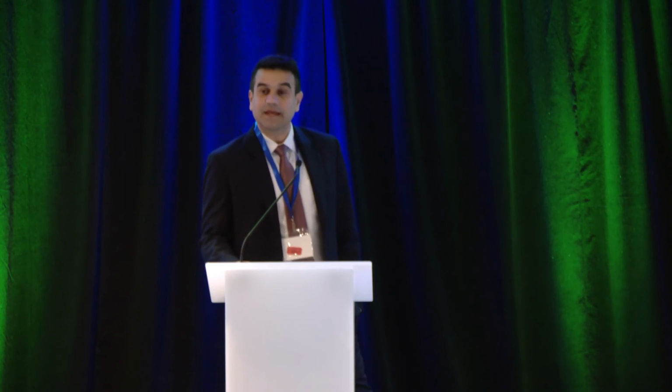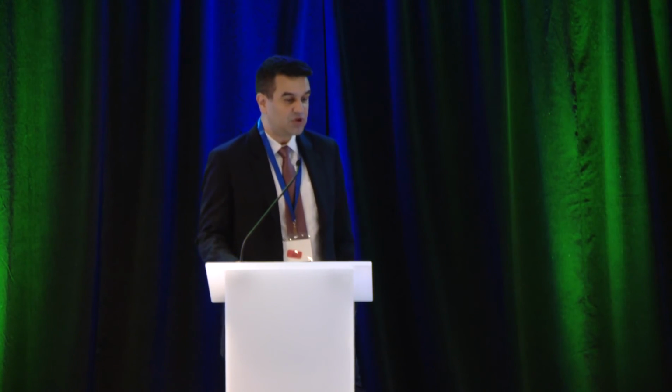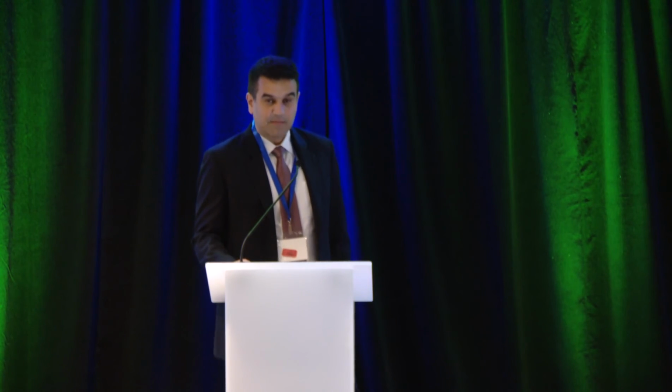You've heard about this already. The first step is to ask, do you have an abnormal median IRP in your primary position? If you do, and you have 100% absent peristalsis, meaning all swallows are either failed or premature, you have achalasia. You might get there as well if in the second position you've also done some swallows and you still have that elevated IRP. Then depending on the pattern, you will have a certain subtype of achalasia.